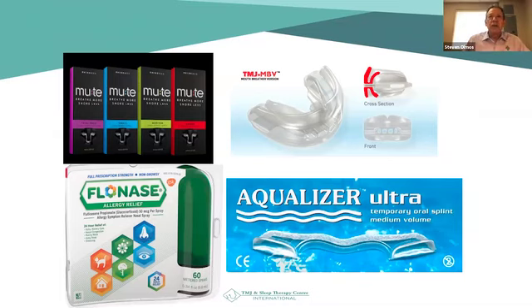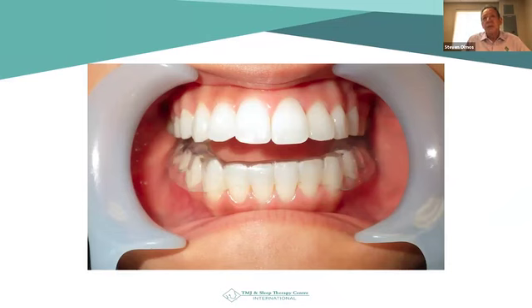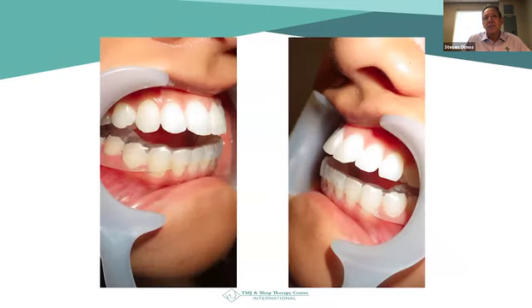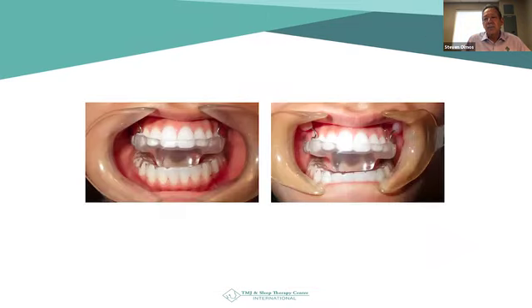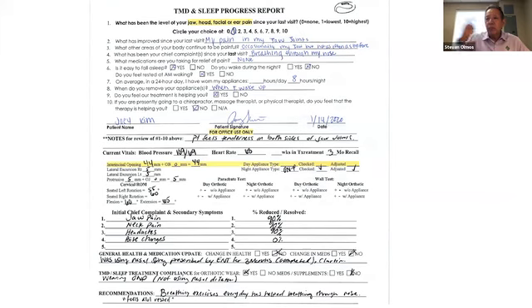Just 2 days later, we had her up to 40 millimeters. And then we were able to insert a positioned appliance for her in the daytime and one for nighttime. She wore those for 10 to 12 weeks. Then with a 60% reduction of pain, range of motion increased to 45 millimeters at this point. And then 3 months later, after we had weaned her off of the day appliance, so she's only wearing the night, now she reports a 90% reduction in all of her symptoms.